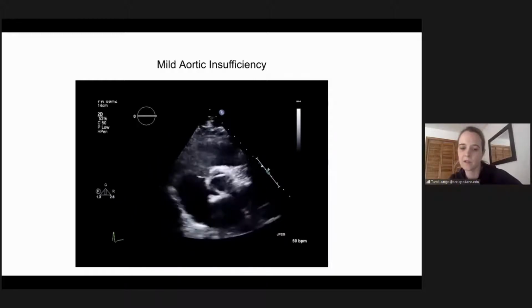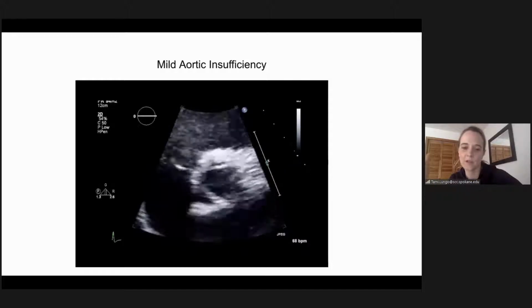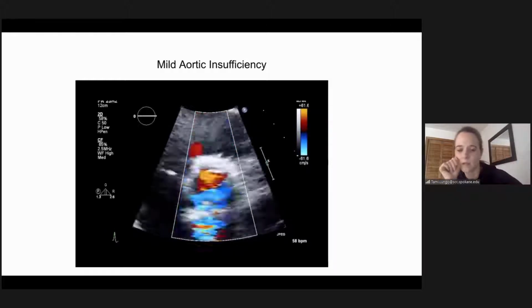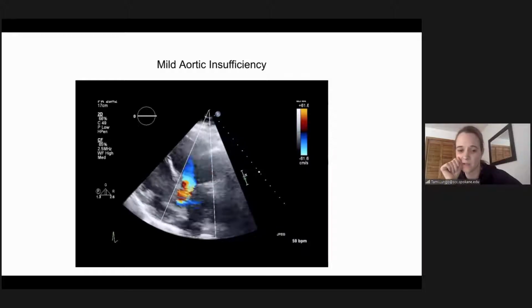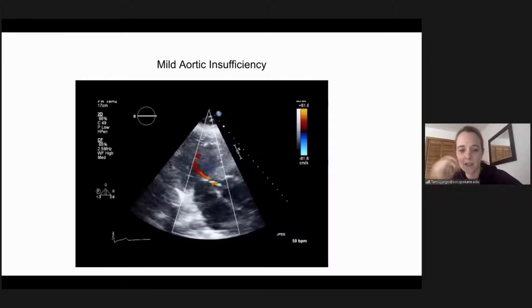It's a beautiful look at the aorta. And so we're showing black and white of the aortic valve in the parasternal long, color in the parasternal long, black and white picture at the short axis, color on the short axis. Anywhere we can see this aortic valve. I think they're trying to show a 5-chamber, kind of looks poor. And then the AI is right there too. So black and white and color. Again, there's your 3-chamber, black and white, and then color.